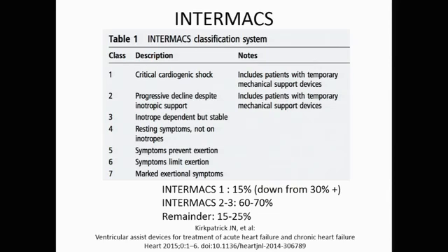Many people think that it's not ethical or appropriate to insert these devices in patients who are INTERMACS 6 or 7. There are centers that do that. I have no doubt, once again, as these devices get smaller and there's less morbidity and mortality associated with inserting them, you're going to see their use creep down to the bottom of this list.